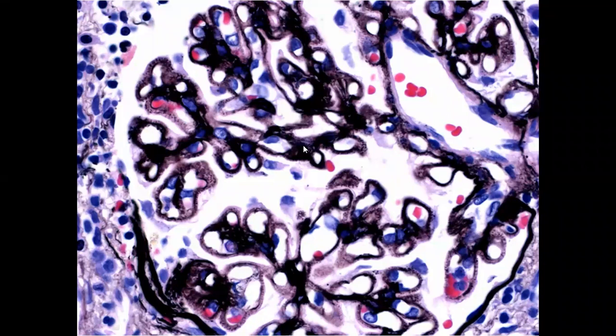So it is opposite. You have to remember, normally the glomerular capillary basement membrane is silver positive. When I say silver positive, that means it is black in color. When you see some paleness in the glomerular capillary wall, that means these are possibly deposits. So the pale thing is deposit and the dark thing is the normal glomerular capillary wall. When you see this kind of appearance on silver stain, you start suspecting that possibly I'm dealing with a membranous glomerulonephritis or glomerulopathy.